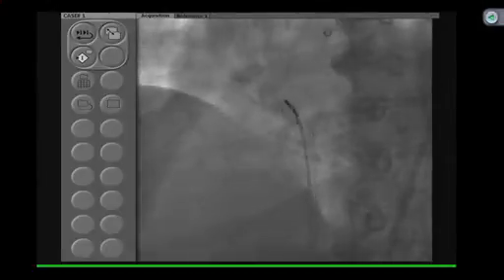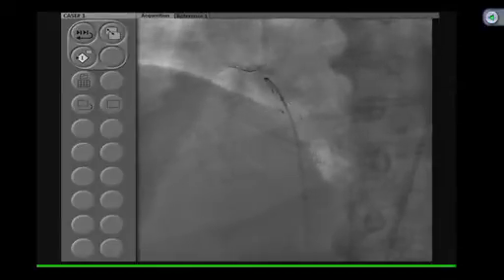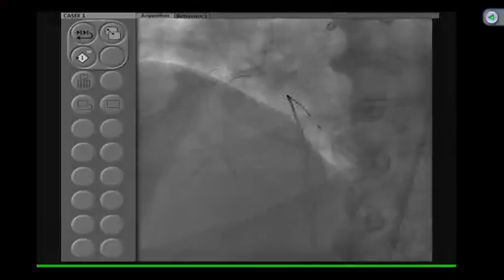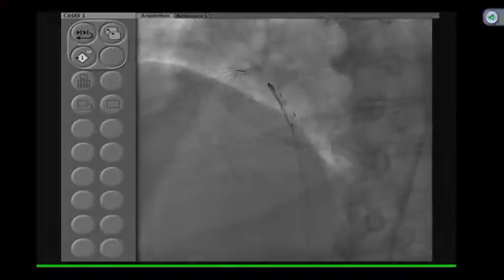Now, with that note, what Annu will do meanwhile is trying to put a rota wire, and usually these complex long cases, it is always better to use a fine cross and using a fielder wire or run through and then change it to the rota wire. Although rota wire can go directly also in this case.